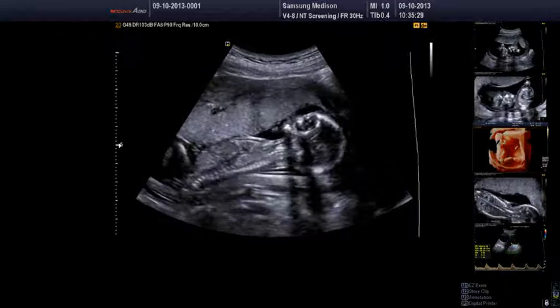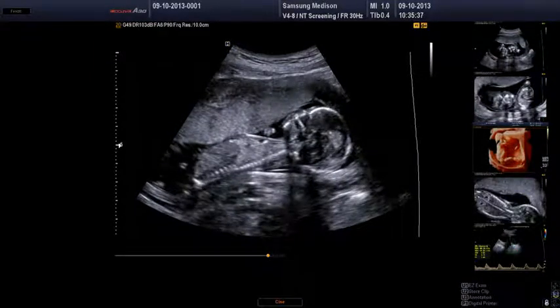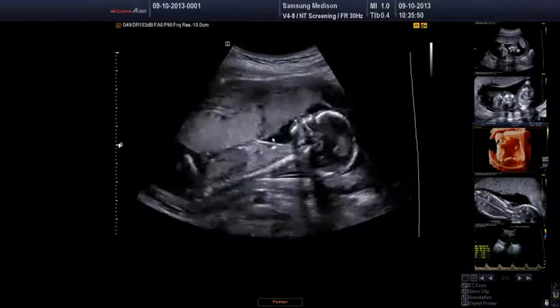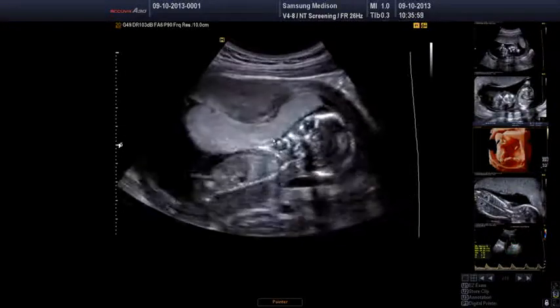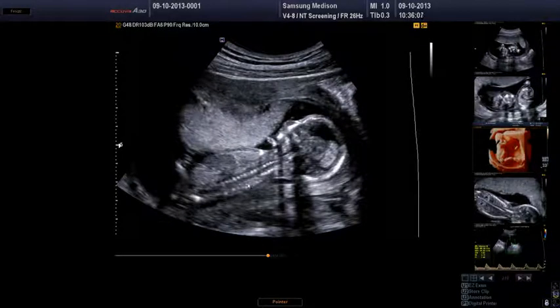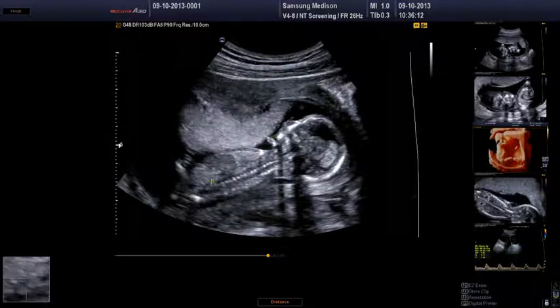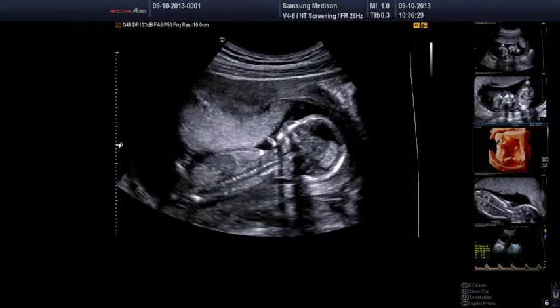So just because this little baby is behaving at the moment, we might start by trying to measure the crown rump length. Ideally, we'd want to make sure that the fetus isn't overextended, and we can look at the angle of the neck and also the gap between the fetal chin and the thorax to help us do that. Often with fetuses that are slightly bigger for first trimester assessment, you find the head is slightly out of sync in terms of alignment with the fetal thorax and abdomen. So sometimes it's surprisingly difficult to get the view that you want to measure a CRL. But here we're getting about 97 millimeters or so, so you can see that we're above the upper limit that we would normally use for first trimester screening, which is 84 millimeters.